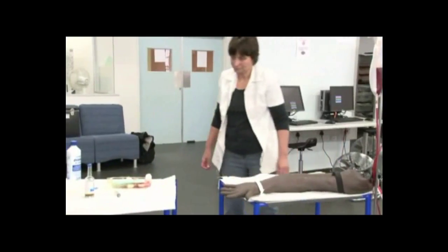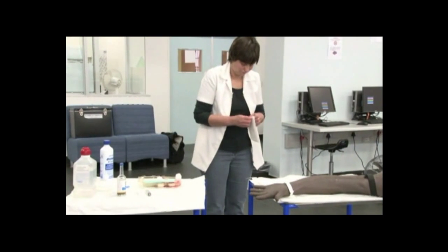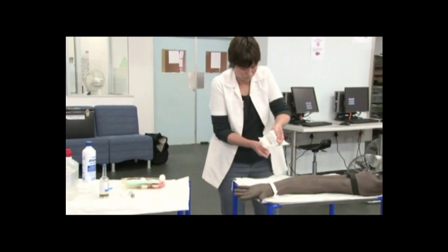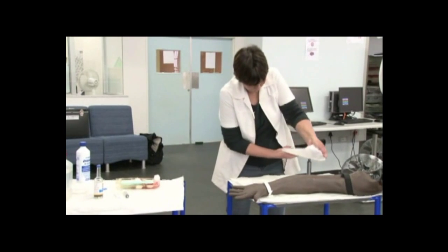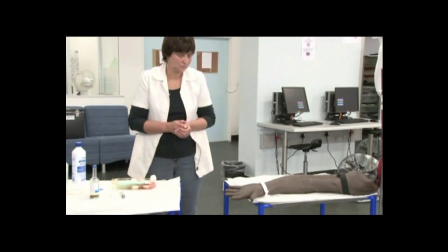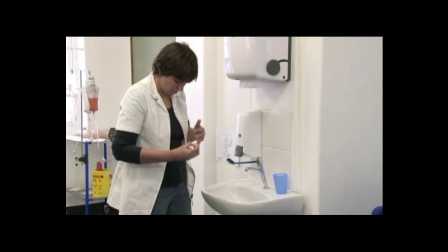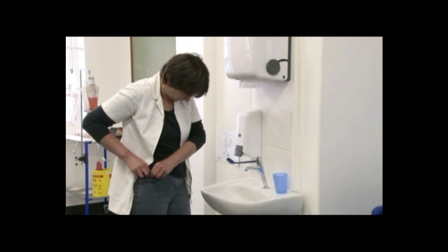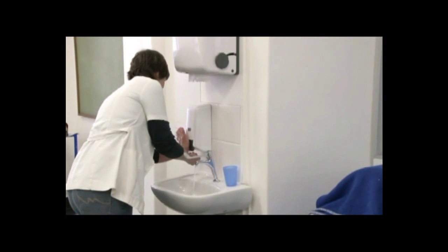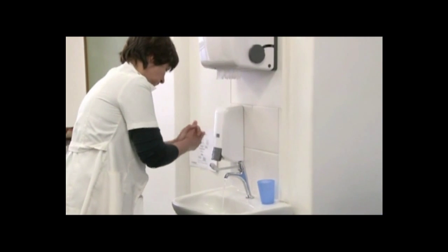Before rewashing your hands, open your sterile gloves onto the sterile field. You are now ready to wash your hands with soap and water and re-degerm. Before washing your hands with soap and water, remove jewelry, watches, and roll up your sleeves. Wash your hands with soap and water, dry your hands well, and degerm your hands with disinfectant.